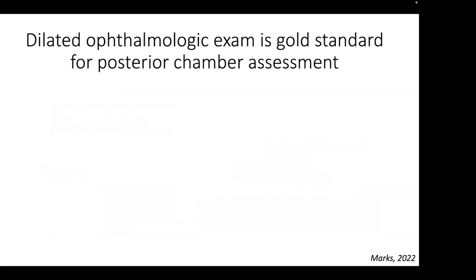Of course, we all know that dilated ophthalmologic exam is considered the gold standard for assessment of the posterior chamber of the eye. Although access to trained ophthalmologists can frequently be limited, either because of availability at a particular institution or because of the time of day and the ophthalmologist's availability.